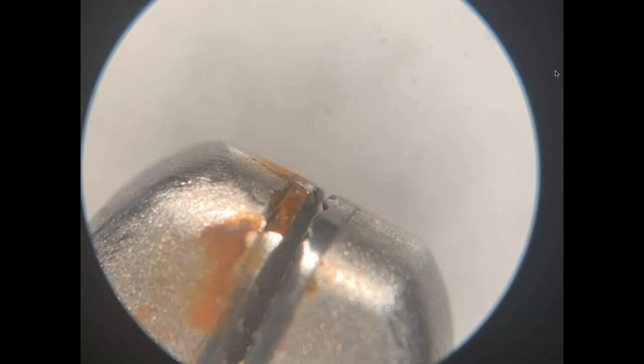Yeah, definitely. And I think it's a similar thing. This is the needle holder image I mentioned. You can really see how I couldn't even see, and I saw this device with the naked eye. You can't tell that the tungsten carbide is chipped, but it's chipped, and there's also the side of the needle holder that is damaged, and that started leaching out iron after it started to corrode.